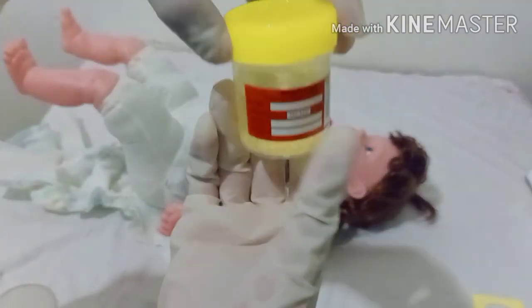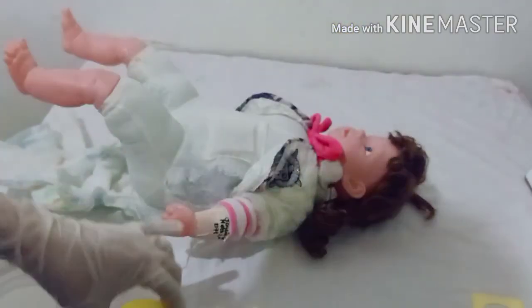This is to avoid contamination of the urine specimen. Fill out the requisition form and send it to the laboratory with the specimen as soon as possible. For best result, bring the sample within 30 minutes of collecting it. Perform hand hygiene and then document the procedure.